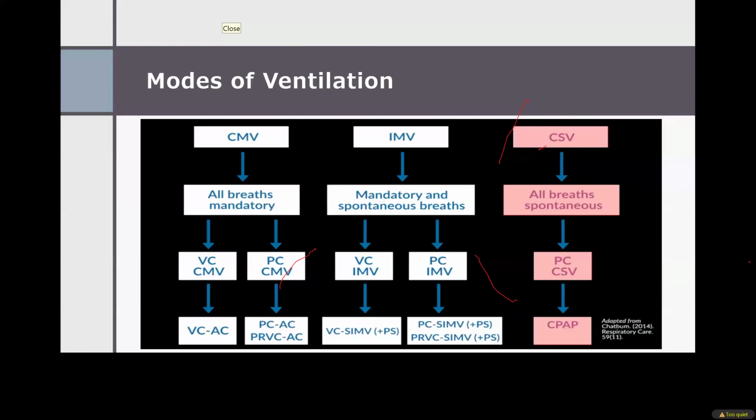For babies on CPAP, are the interfaces changed? Yes. CPAP by itself can be delivered a number of different ways. We have the prongs, we have the masks, and there are different kinds of prongs and masks as well. And then people use some other agents like barriers to make the seal better. So in a particular baby, especially with breakdown of the nares, I think we use masks more. But we usually start with prongs.